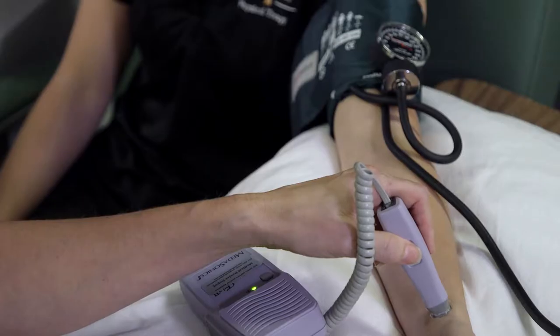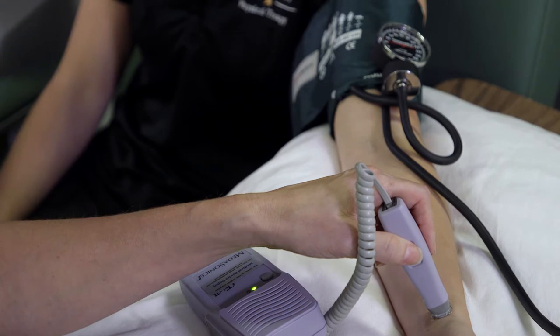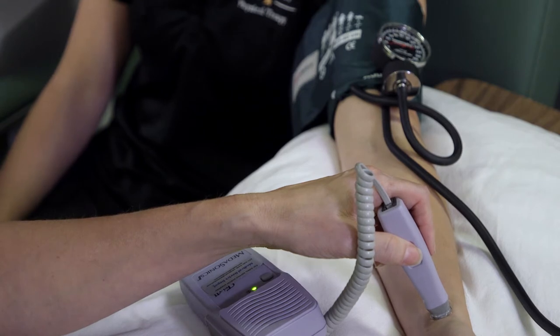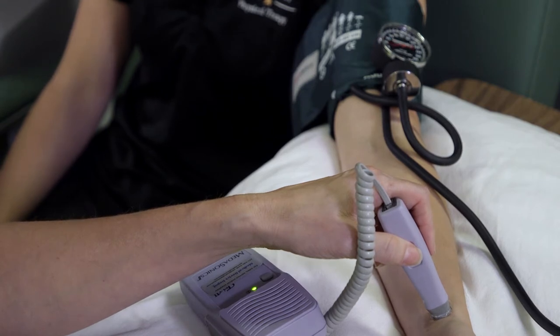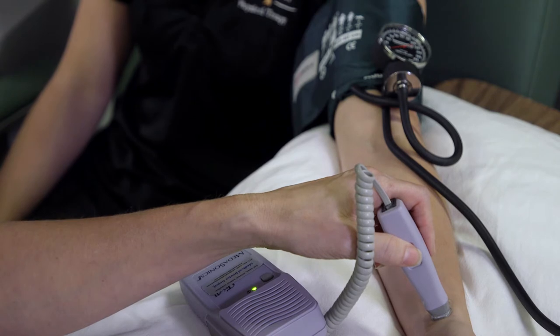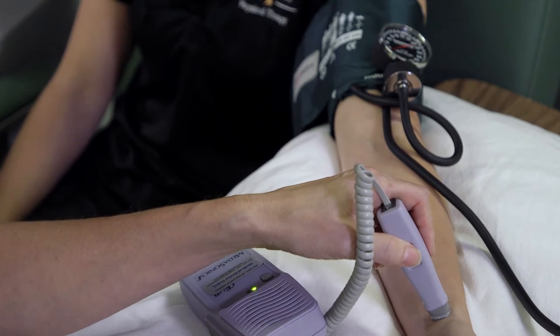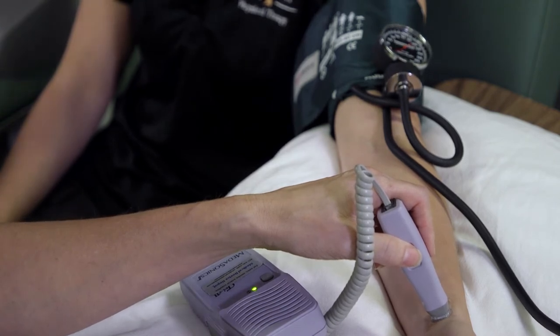Now listen as the Doppler detects the point at which the pulse reappears during blood pressure cuff deflation, which is consistent with the systolic blood pressure.